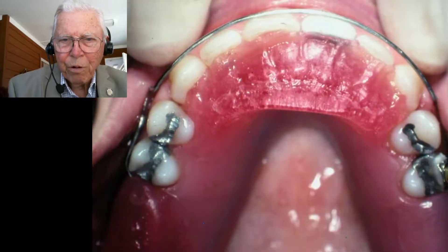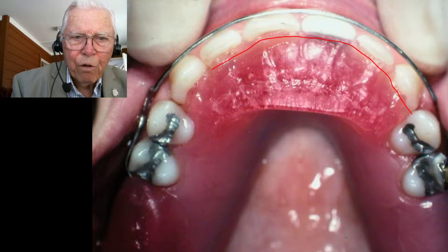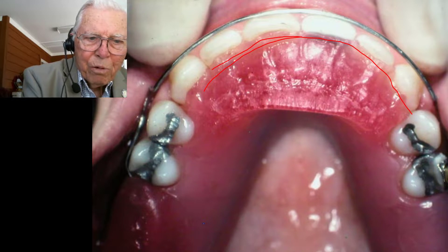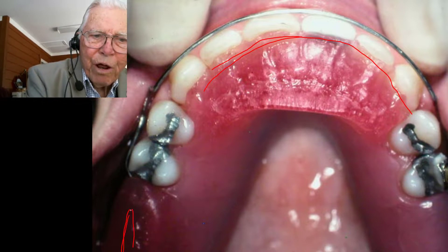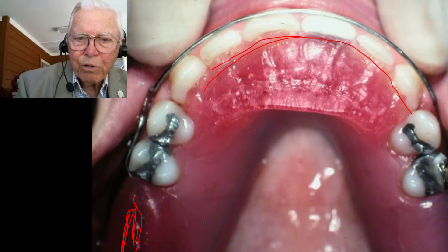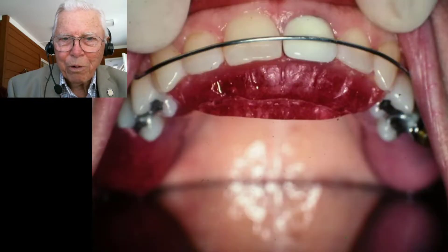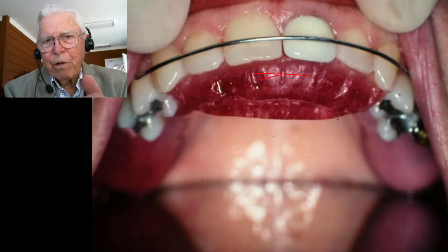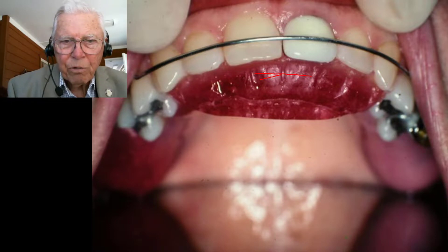This is tough, hard stuff to do. We had to advance the mandible out to where we were going to use it to bring the jaw forward, so these teeth fit into here. The teeth on the right side would meet the permanent teeth below. We could add to this gradually, and that would depress the lower molar teeth. It takes a little ingenuity, and you wouldn't want to jump on a case like this unless you're really going deep into orthodontics. You can see the track of the lower teeth right here — we're just behind the upper teeth. We gave her enough overjet and overbite where she could bite her teeth together and have her back teeth not hit.